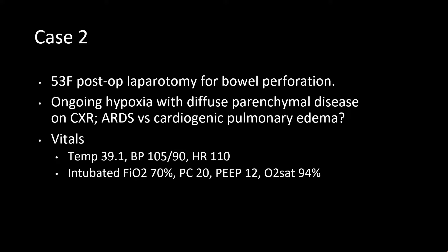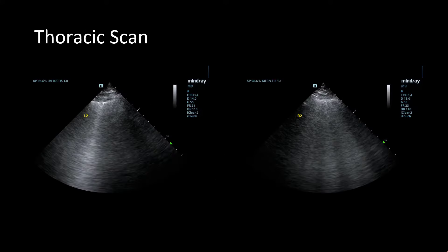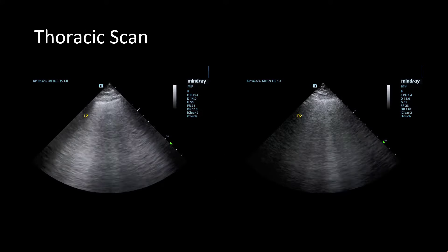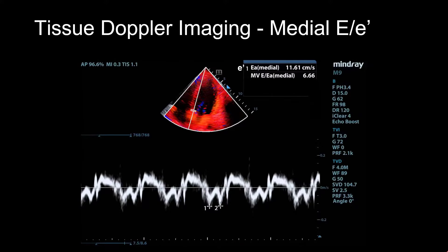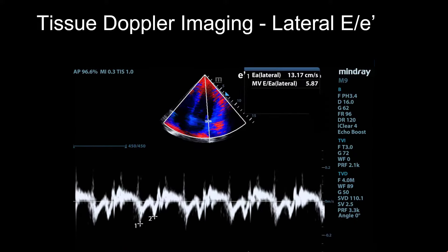Case 2: a 53-year-old female post-op laparotomy with ongoing hypoxia and diffuse parenchymal opacities on chest x-ray. Her thoracic scan showed diffuse B lines anteriorly. Pulse-wave Doppler shows an E velocity of 77 cm/s. Medial tissue Doppler imaging shows an E-prime of 11.6 cm/s with a medial E over E-prime of 6.6. The lateral E over E-prime was 5.8. Averaging the two gives an E over E-prime less than 8 — therefore the B lines are secondary to an infectious or inflammatory process, consistent with ARDS and unlikely cardiogenic pulmonary edema.